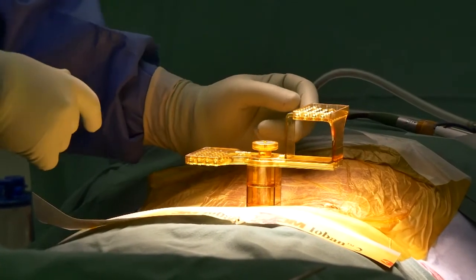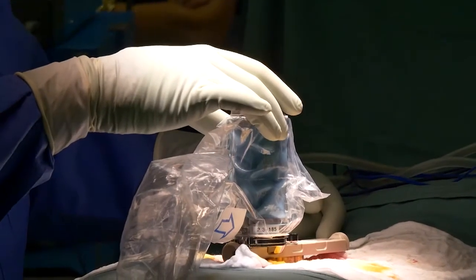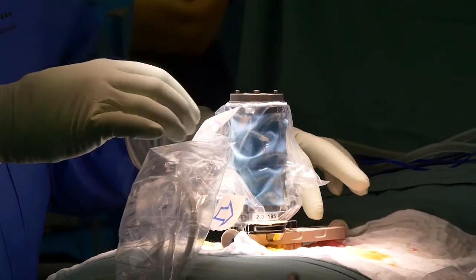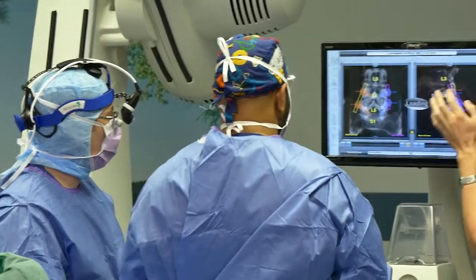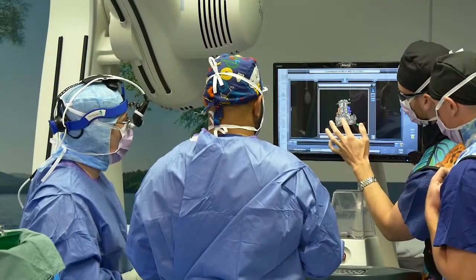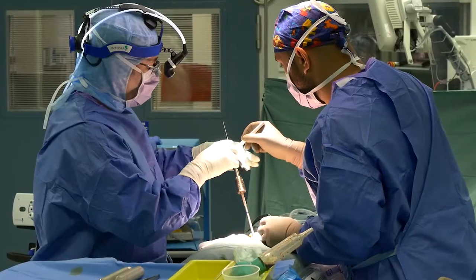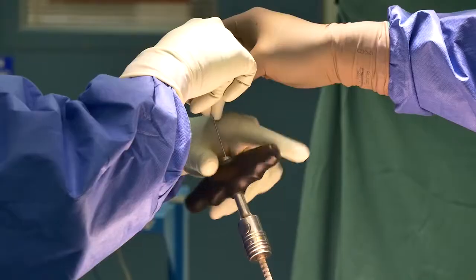The second step is to attach the robot to the patient. This is done while the patient is asleep at the start of the operation. This allows the computer to tell the robot exactly which position it needs to be in in relation to the patient's spine. This then allows the surgeon, with the assistance of the robot, to place the screws in exactly the right spot.